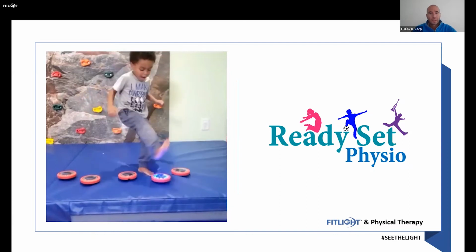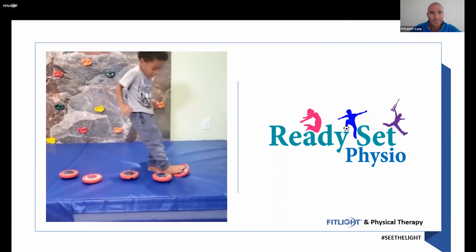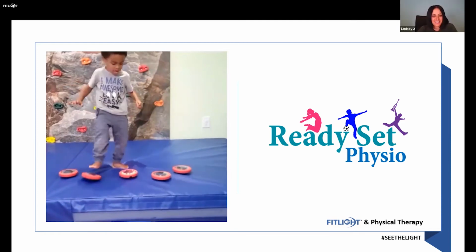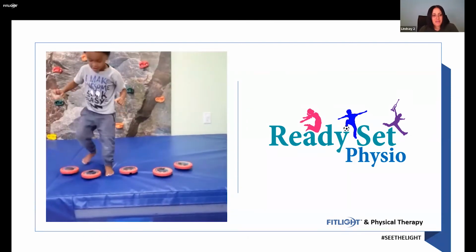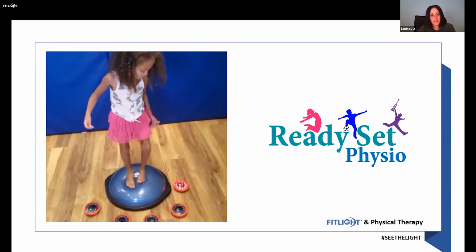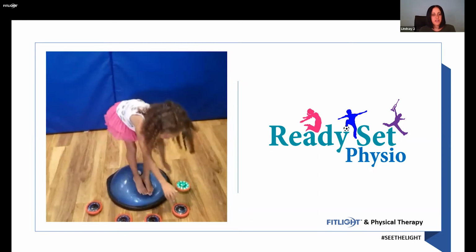Can you explain what it is that we see here? Well, obviously we see a kid using the lights. But what is the kid doing and why? So this is something I would work on with single leg standing, and obviously the video will loop back, so we'll get another chance to look at it, but making it harder here on a BOSU.